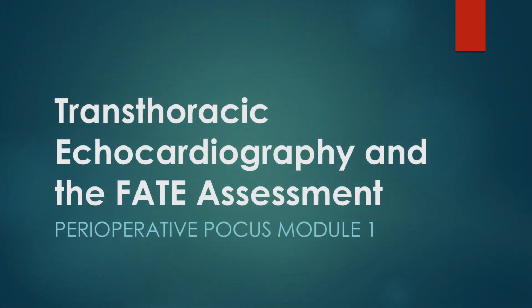This presentation is over transthoracic echocardiography and the focused assessed transthoracic echocardiography assessment, or the FATE assessment. Ultrasound is the only method which enables real-time bedside imaging of the heart, and focused assessed cardiac ultrasound provides very diagnostic information to bring about changes in the perioperative management. TTE allows rapid, non-invasive, point-of-care assessment of ventricular function, valvular integrity, volume status, and fluid responsiveness.